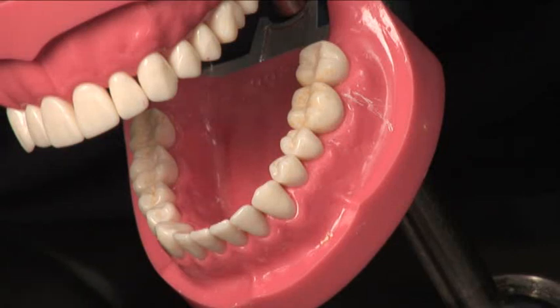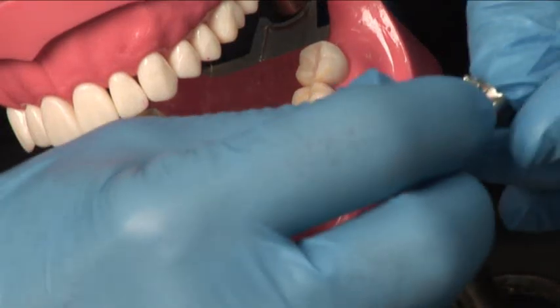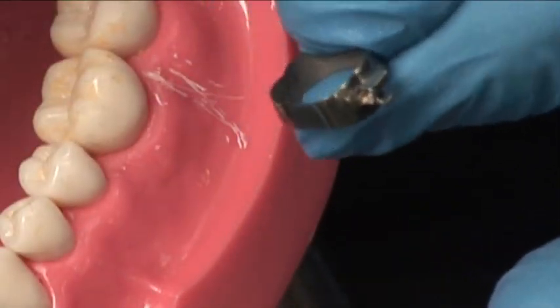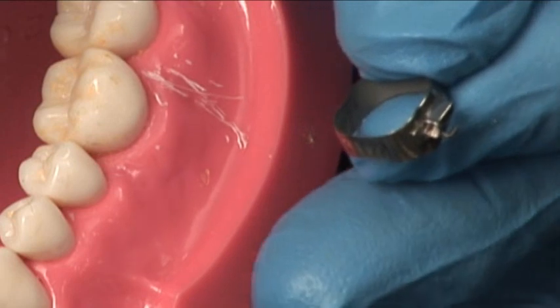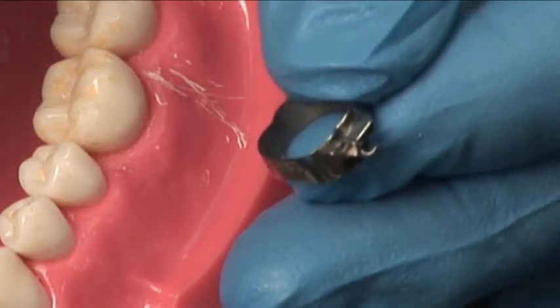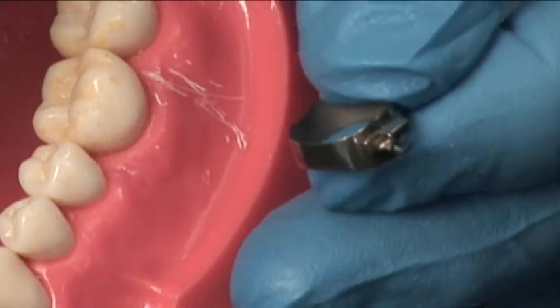One of the things that you have to realize is that each tooth is shaped a little bit differently, and so once you get a band that is fairly close, you have to contour the band. What we're going to do is use this band here today. We're going to put it on the tooth, and then we will contour it, we will remove it, and then we will cement it. Okay?